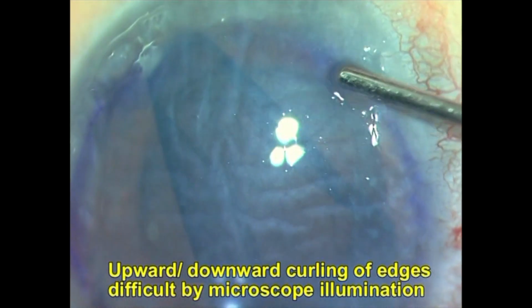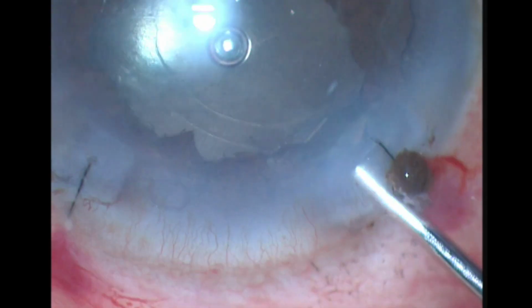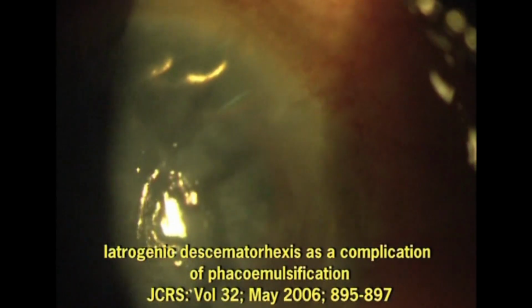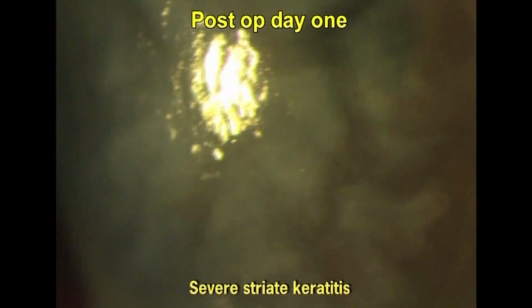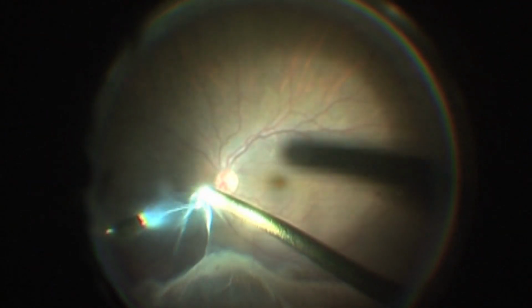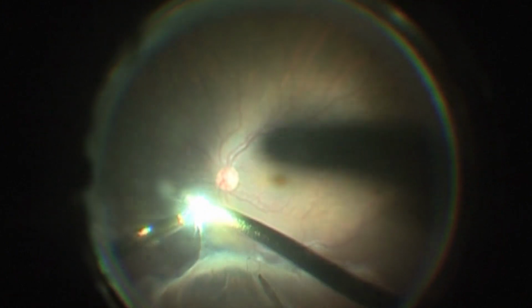In case of inadvertent trauma to the Descemet's membrane, it can cause Descemet's membrane detachment, which might be very small and can get unnoticed, causing long-term corneal edema. Endo-illuminator light, when it falls at an angle, can help in the visualization of these small breaks in DM. Vitrectomy endo-illumination attachments are often available, which allow aspiration, infusion and vitrectomy.